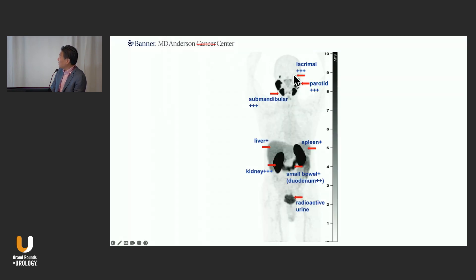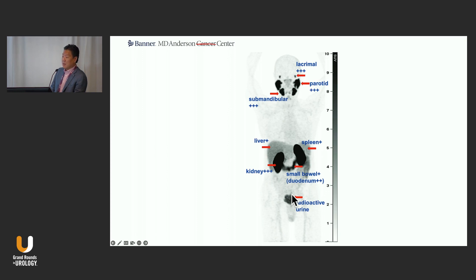This shows glandular activity — parotid, submandibular, lacrimal glands. You get kidney, liver, spleen, and a lot of different areas where this is going to localize to, because PSMA is expressed in some of those areas or sometimes just gets trapped there. Even though it stands for prostate-specific, it's not 100% prostate-specific.